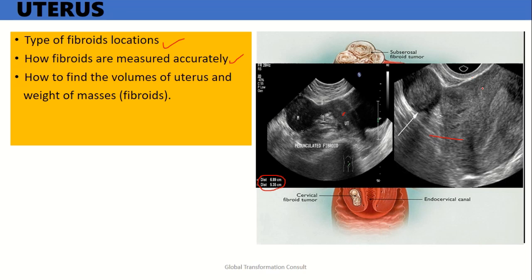In a transvaginal ultrasound, you can see the endometrium here in this image. And you can see the myometrium. You can see other small fibroids in the myometrium with vascularization. You can see the arteries also here. This small fibroid here, and this is a huge one on the right side of the patient, and you can see a collapsed or compressed blood vessel feeding this fibroid.